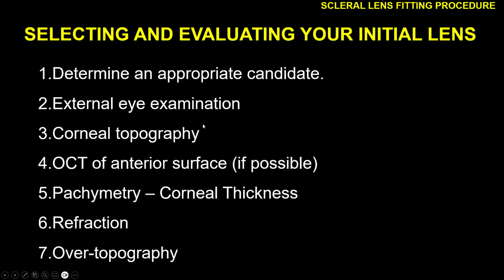External eye examination cannot be overemphasized. Very important to have a look at that. Corneal topography, and I think I need to pause to say here that for you to practice scleral contact lens fitting properly and efficiently, you need a topographer. In fact, that's one of the things you need. You need a topographer minimum.